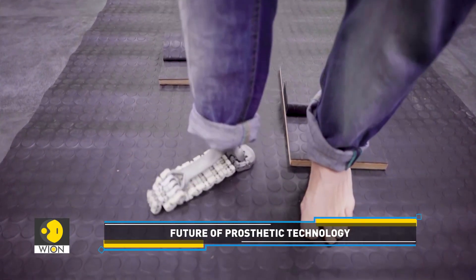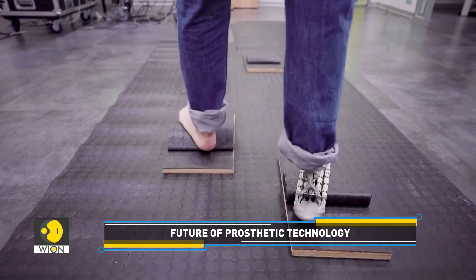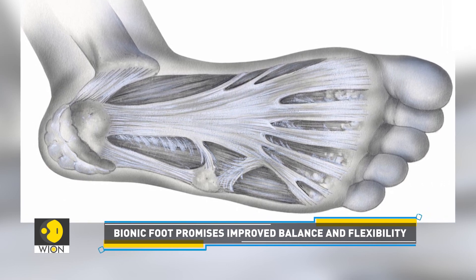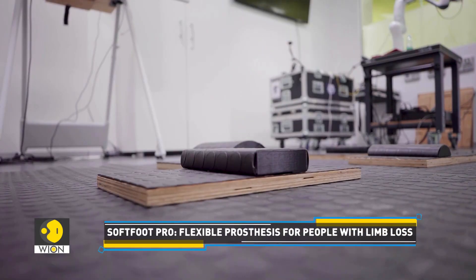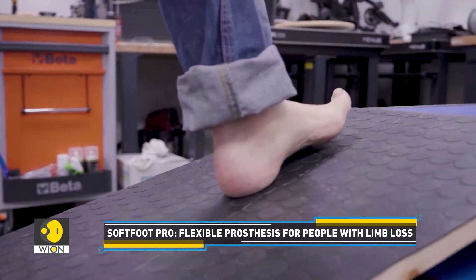The SoftFoot Pro comprises a titanium arch mechanism connected by plastic chains that emulate the plantar fascia of human feet. Plantar fascia is a thick ligament that connects your heel to the front of the foot. The design allows the foot to distribute force evenly during walking, making movement more efficient and natural while also absorbing impact on the ground.